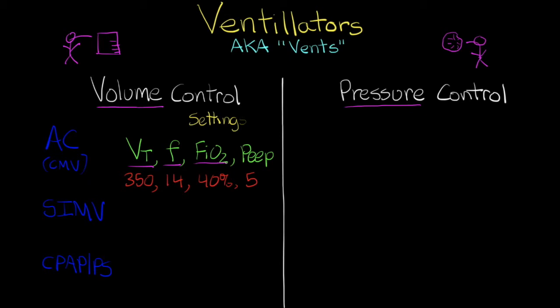And it is important because the FiO2 is one of the gauges that we look at to see how much support we are having to give to our patient. So someone who is requiring 40% oxygen is getting a lot less support from the ventilator than someone who's on 80%. So it's a good indicator of how much support that patient is requiring to satisfy their oxygenation requirements.